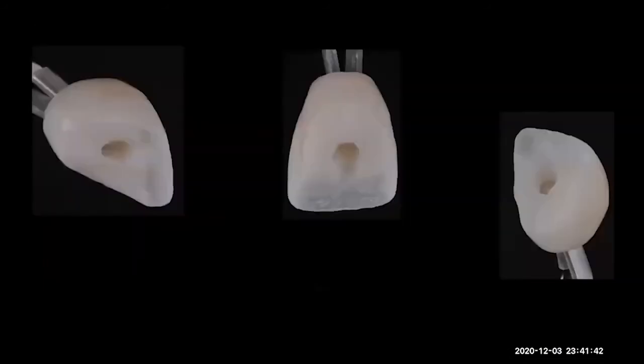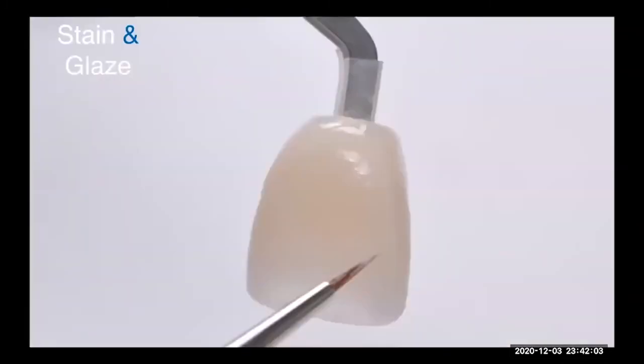You see, we can do it little by little. It was a long time ago that I did this case. At that point we are doing little by little with a nice instrument like a lentil shape. I've been doing my concavity calibration until I get the point that I like.